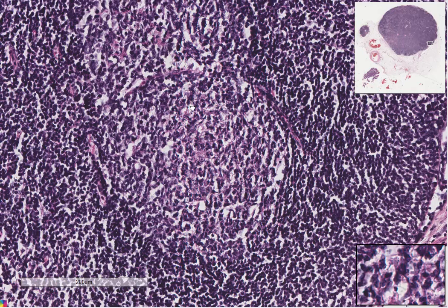They become apoptotic. The cell stops them from dividing, they become apoptotic, and the tingible body macrophages eat them up.